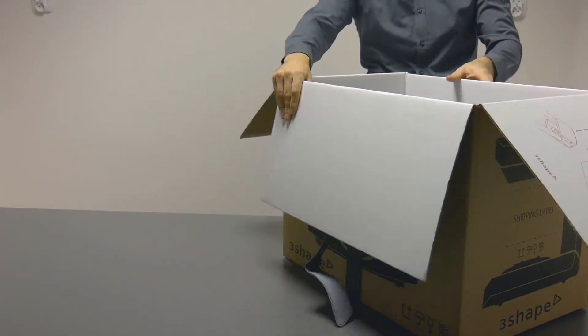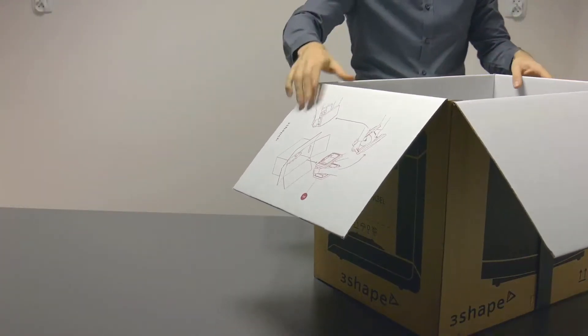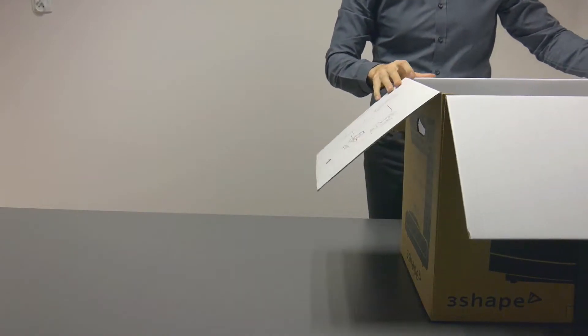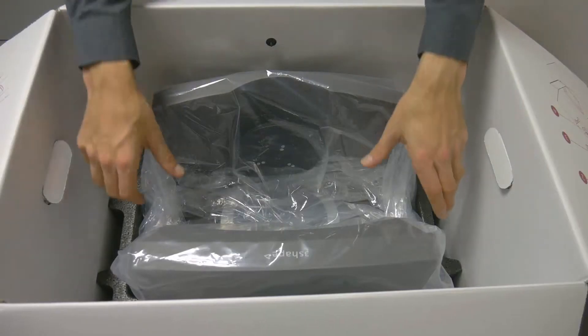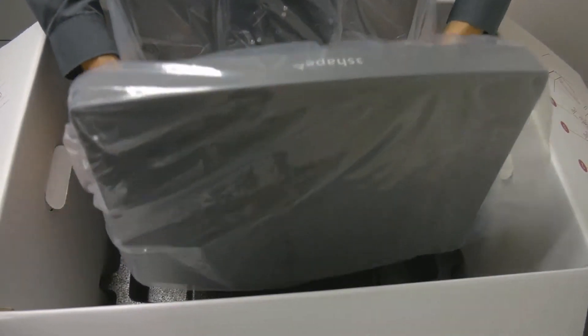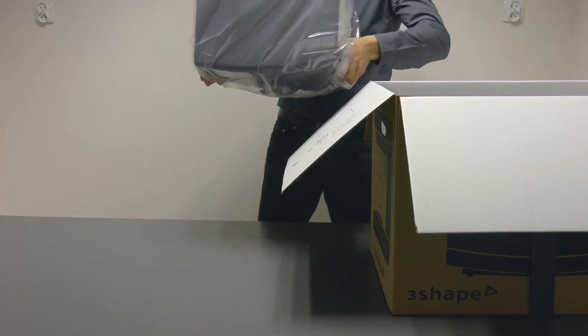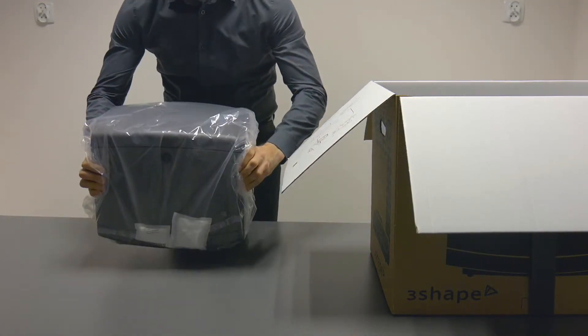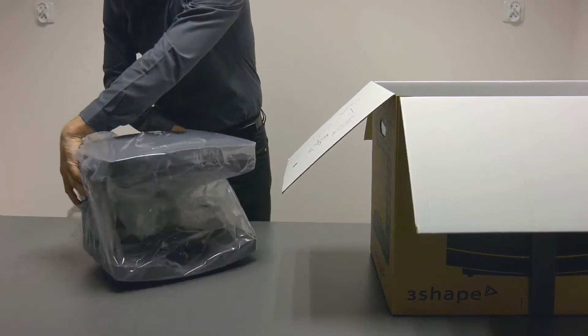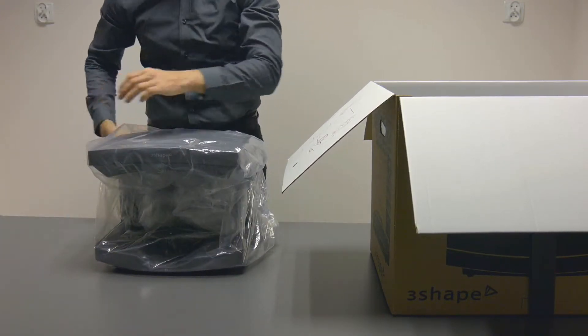Before you lift the device out of the box, rotate it so that the base of the scanner is closer to you. The scanner will be wrapped in a plastic foil bag. Carefully grab the sides of the scanner and lift it up. Place the scanner on its feet on a secure flat surface and unwrap it.